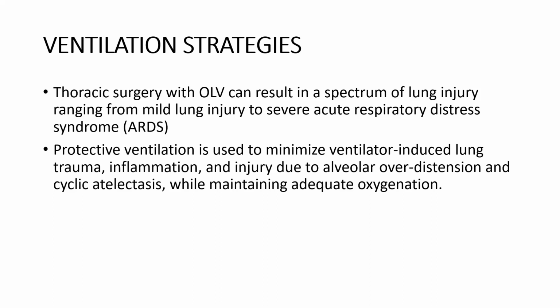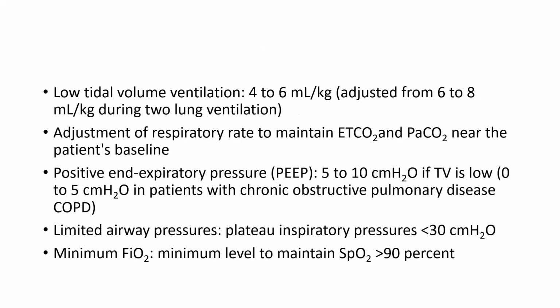This is called protective ventilation, and it is used to minimize ventilator-induced lung injury while maintaining adequate oxygenation. So these are the recommended ventilatory parameters.